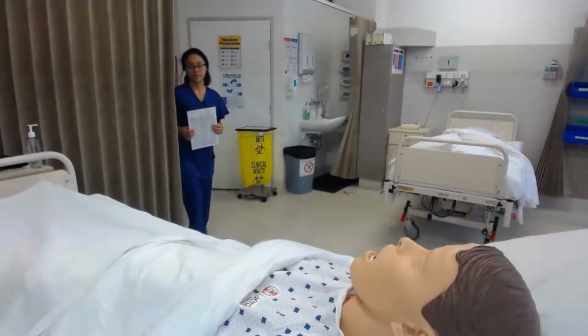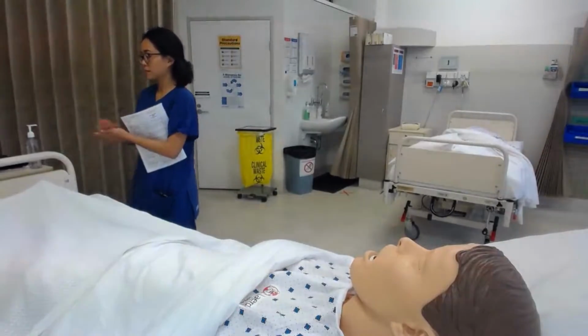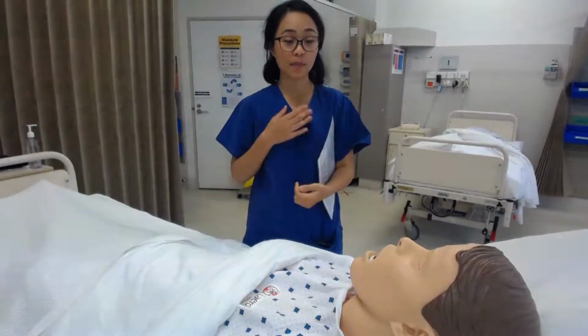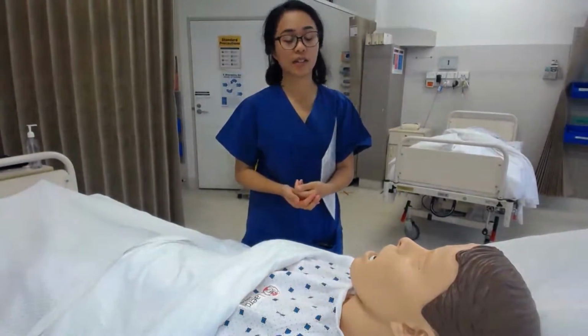Subcutaneous injections involve placing medications into the loose connective tissue under the dermis. As part of infection control, you must perform hand hygiene. Adhere to the 5 moments of hand hygiene in order to reduce the transmission of microorganisms.